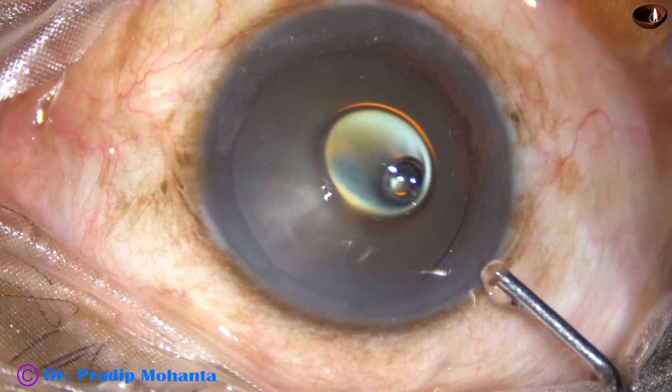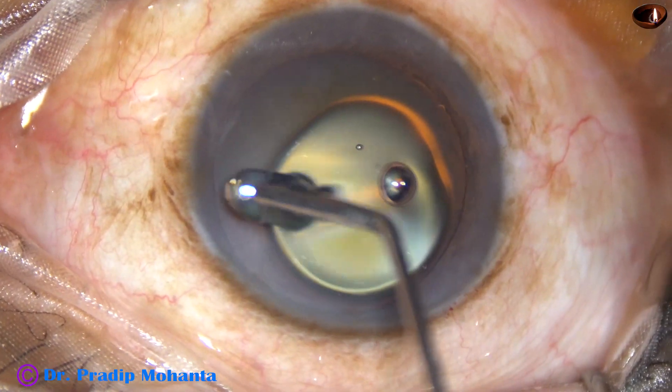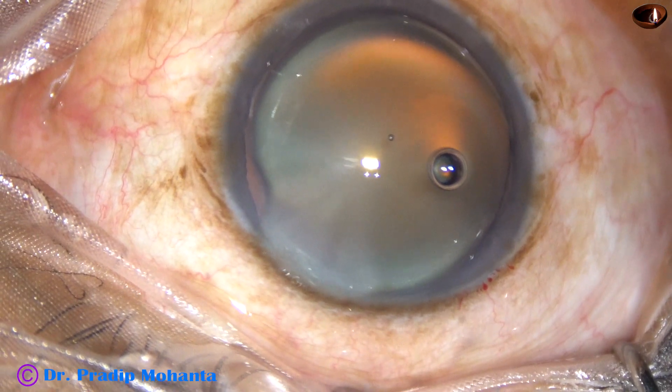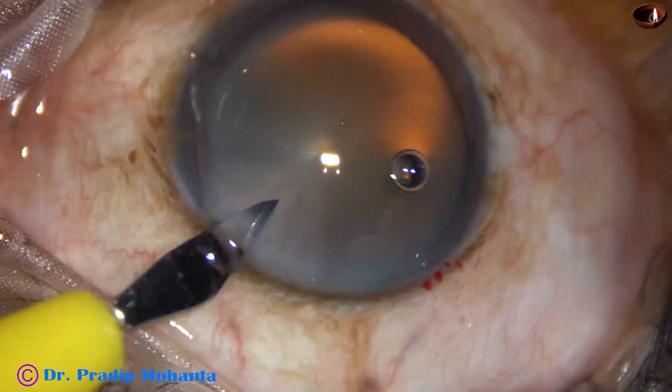After incision, viscoelastic substance is injected into the anterior chamber. Fisco is applied to the corneal epithelium — this improves visibility. Now this is the side port on the left side of the main incision.